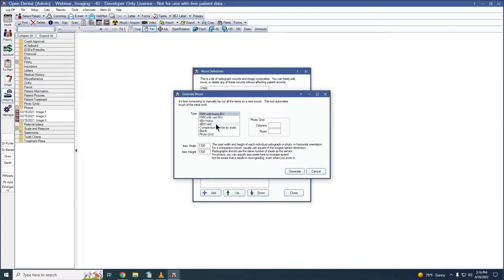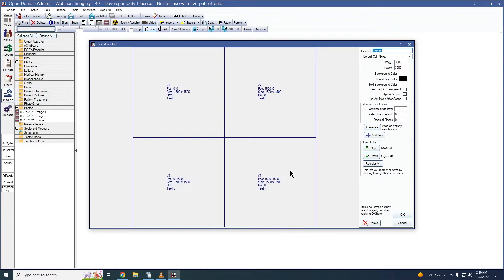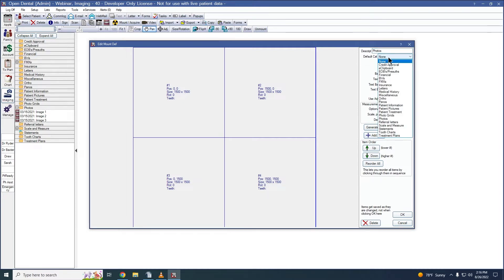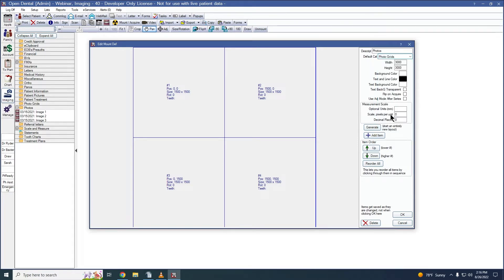You can start with one of our pre-built templates, a completely blank mount, or begin with a photo grid. Let's create a 2x2 photo grid with items that have a width and height of 1500 pixels. Clicking Generate will create our mount definition. Within the mount definition, I can edit the description, which changes the name for our mount. I can set a default category — let's have this one go into the Photo Grids category. I can edit the width and height of my mount; let's set the width to 4000 to make room for another item.